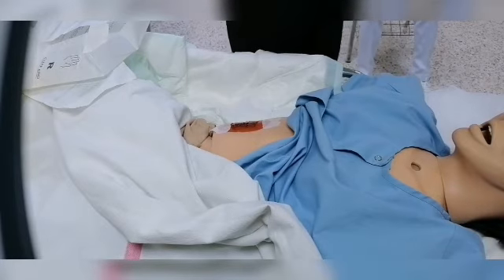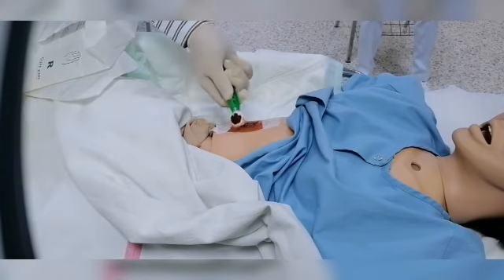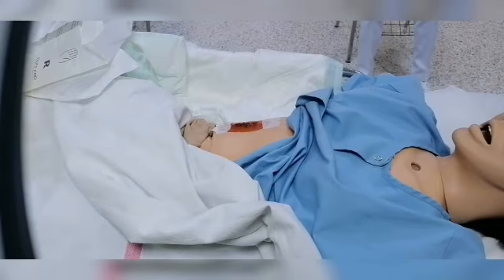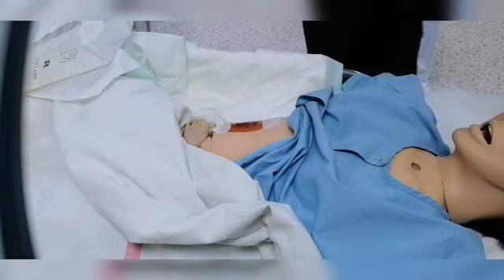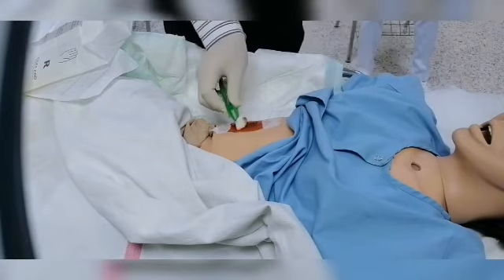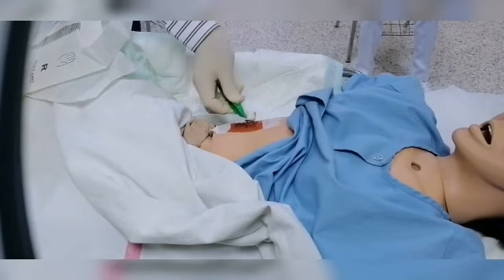I will continue with that, starting from the center of the wound toward the edges, until I finish. Then I have to clean with saline after that, to avoid the irritation of the betadine.